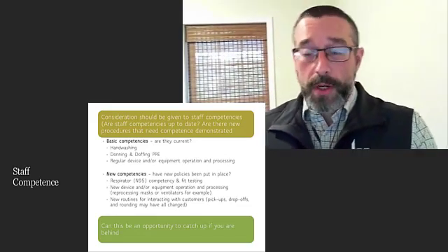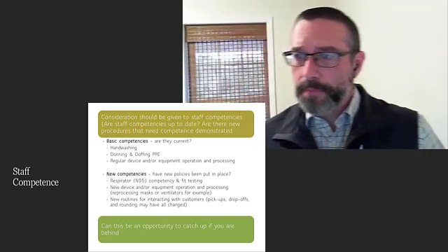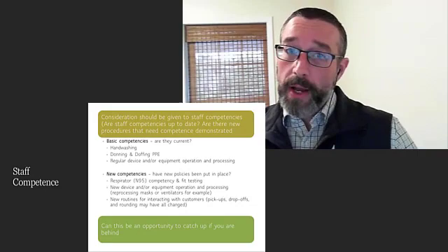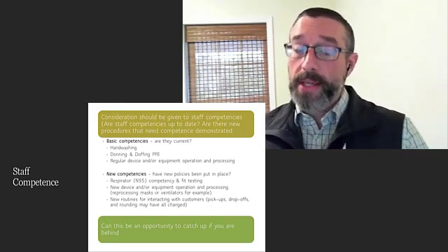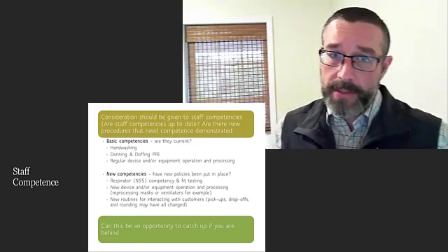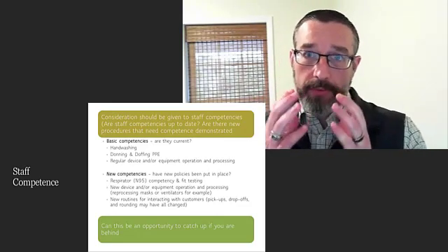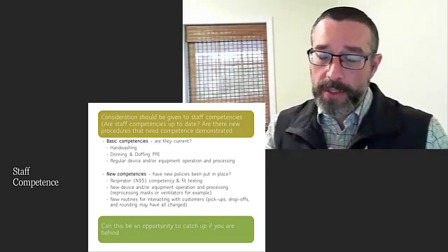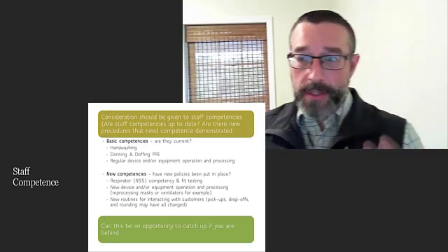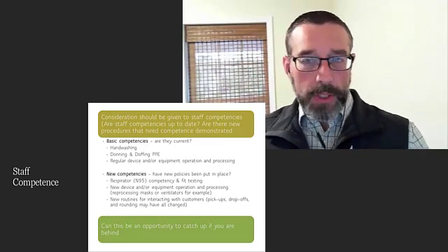Then, of course, we're going to talk about new competencies, because there are going to be things that have come up or have changed because of COVID-19. So if you have any new policies put in place, everyone has to be competent with those too. N95s, not just about reprocessing, although, of course, that's a thing. An N95 has a fit and should be fit tested. So a person needs to be acutely aware of how they handle that mask, how they apply it to their face, and that they have been and are able to be fit tested. Just an FYI, beards are not so great with an N95 mask, and so this is something that has to be considered. Are there new devices or equipment operations that you need to take into account?